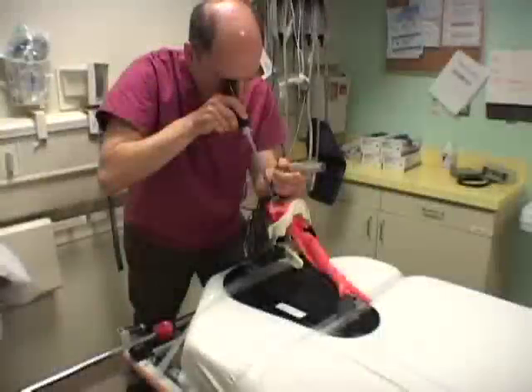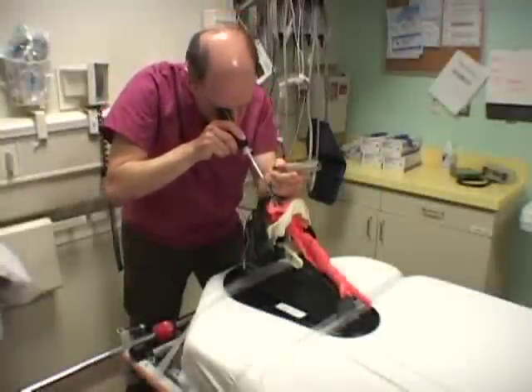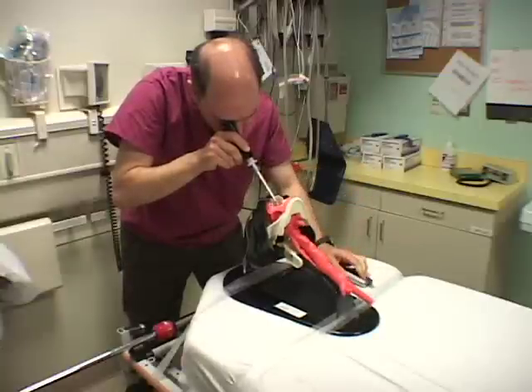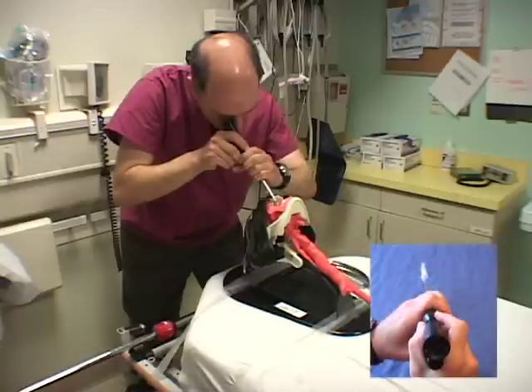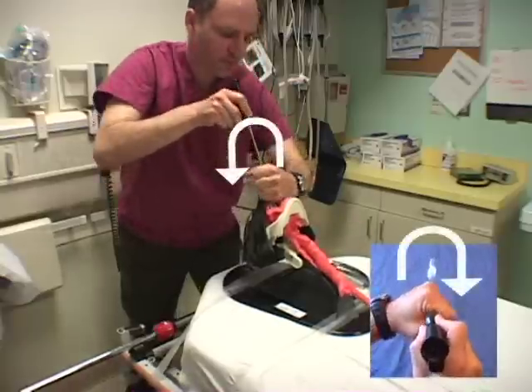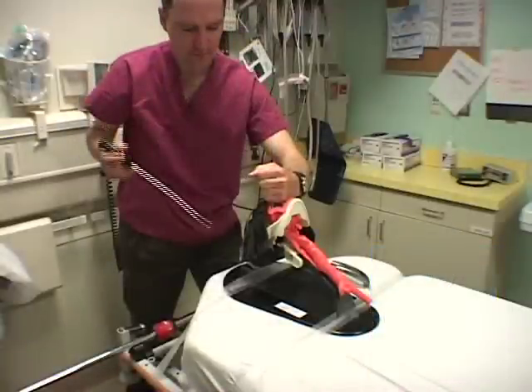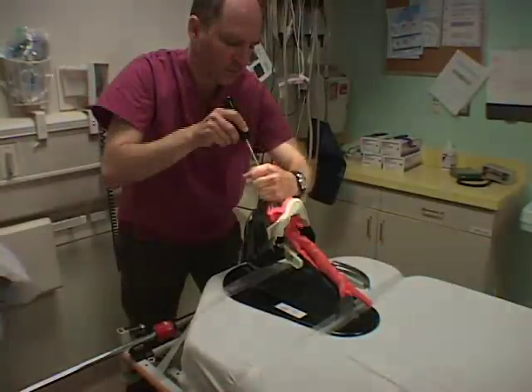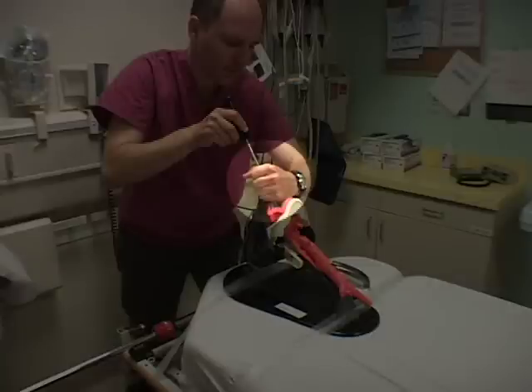After the tip of the scope has been fiber-optically advanced past the vocal cords and into the trachea, the laryngoscope is put down, freeing the operator's left hand. The left hand reaches across and turns the tube clockwise off the stylet and into the trachea to the proper depth. It is important to advance the tube off the stylet and stabilize the tube with your left hand before withdrawing the FPS.